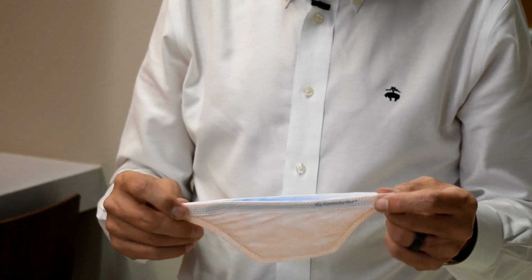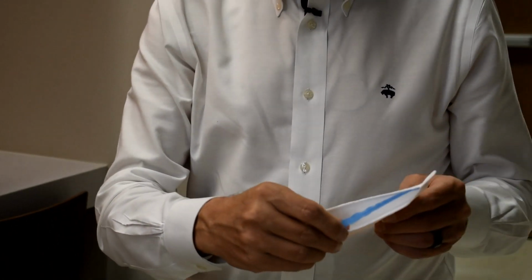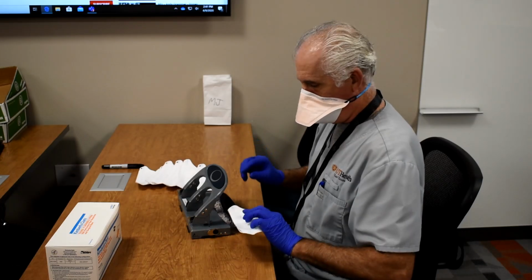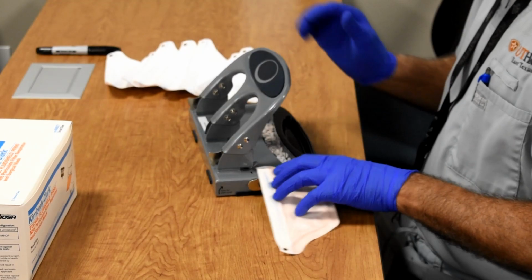We knew that the only issue with these respirators was that the elastic band on the inside is really brittle and kind of dry rotted, so when you try to put it on, it'll either snap or it won't stay affixed to your face. So the first station is hole punching of the blank respirators, the expired stock. So we put two very precisely placed hole punches in the corners.